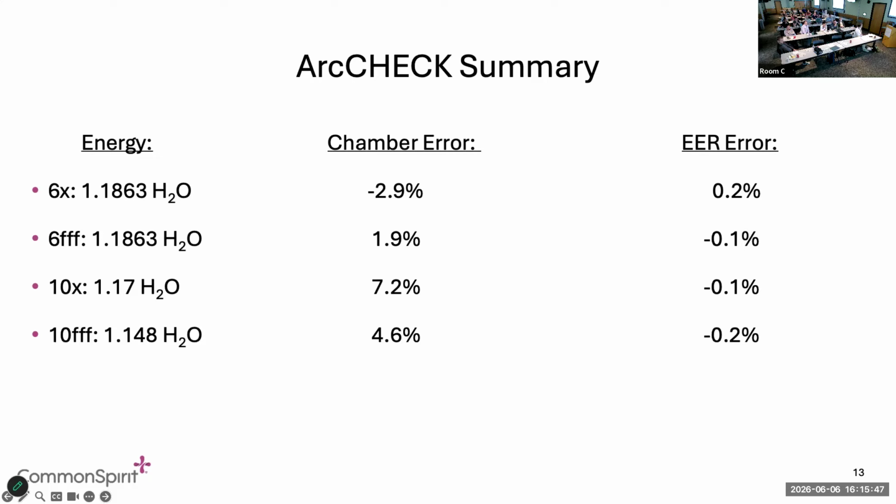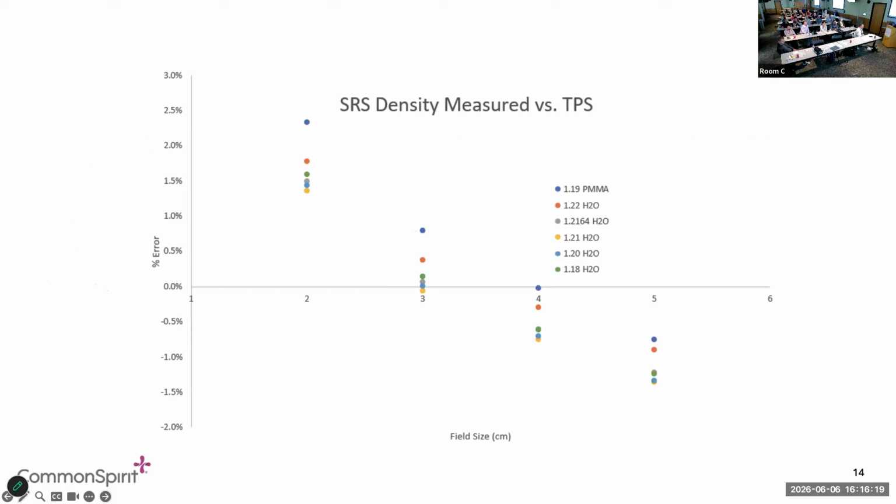And historically, for more than 10 years, I would just use 1.18, 6 or whatever they recommended PMMA. And so what was happening was at those sites, I was getting like 97% pass rates on prostate cancer, or I'm doing a pancreas and I'm getting barely 95, or if I go down to 2 and 2, it's something else. So the moment that you optimize your ArcCheck, or essentially zero it out to your treatment planning system in this way, now you can see how your program is doing.